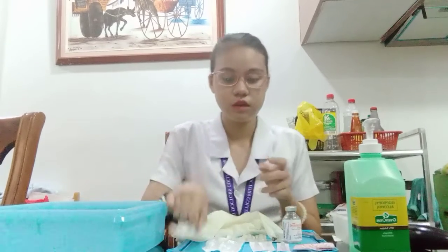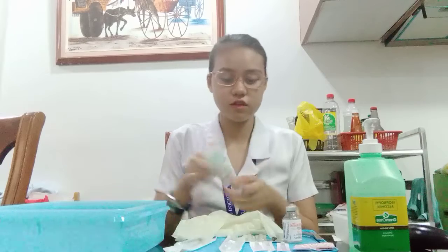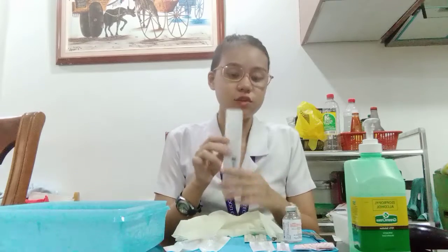Next, we need to arrange the medication card. As you can see here, this is the medication card given, and the hypodermic tray. With the corresponding drug, we need to arrange the hypodermic tray to ensure efficiency. The materials that we will be using are the improvised hypodermic tray, as you can see here. A 1 cc or 1 ml syringe for the intradermal injection, 1 insulin syringe for the subcutaneous injection, and a 3 cc or 3 ml syringe with a 23 gauge needle for the intramuscular injection.